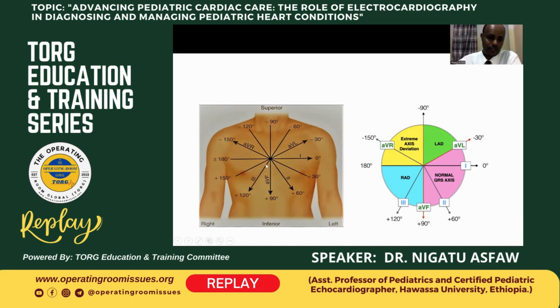And lead 3 will be 120 degrees. And we have 3 augmented leads which are created by the ECG machine by taking one limb as positive and the others as reference.